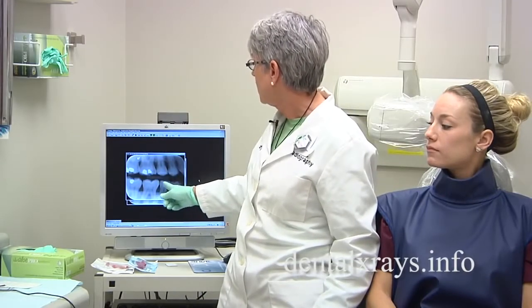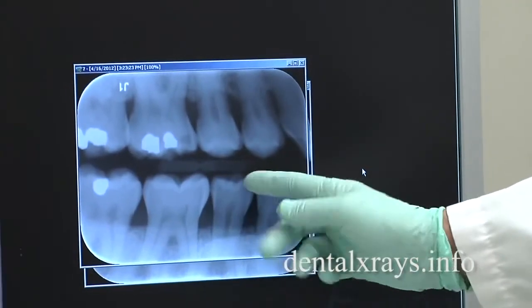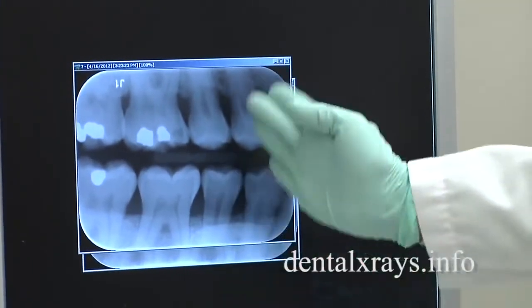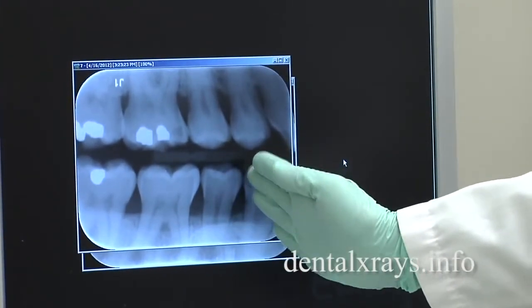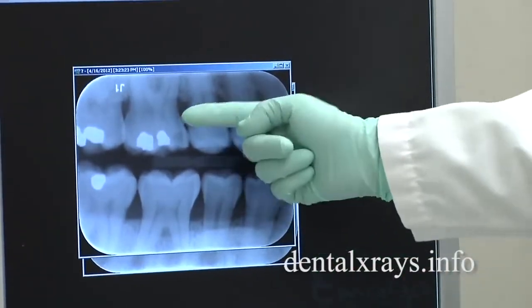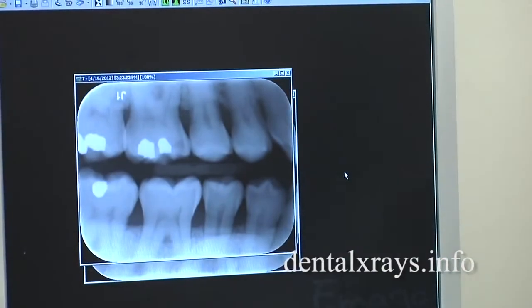Thinking outside the circle — bringing it back and placing your central ray beam through the interproximal spaces of the teeth — you'll have nice open contacts. You can see that we've gotten all these nice open contacts and the distal of the canine.